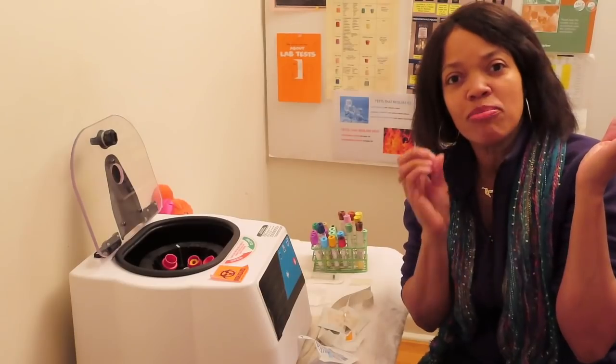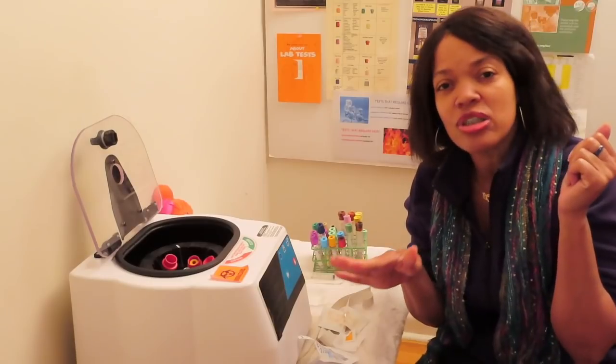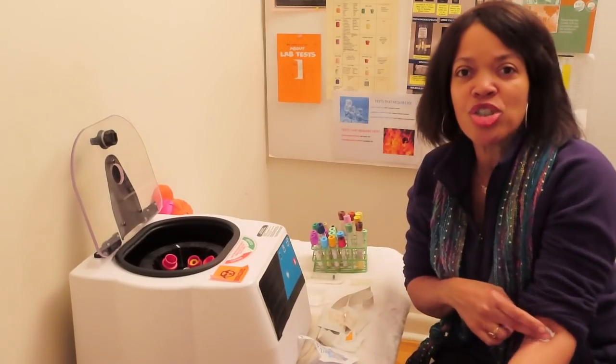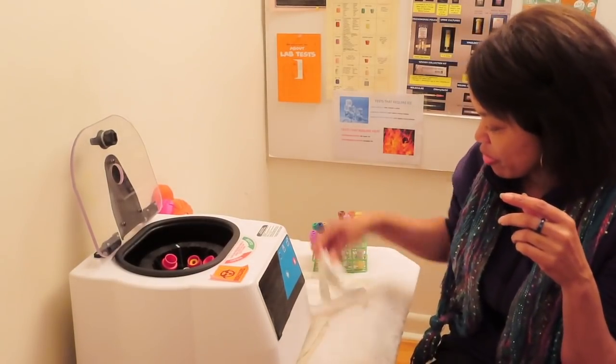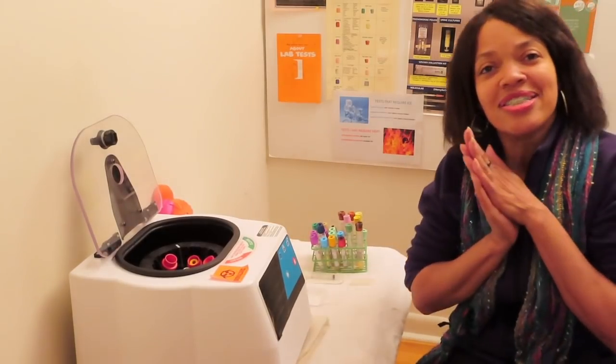Pressure is your friend. Pressure can alleviate bruising. Sometimes it's not the bad stick that causes bruising, it's not applying pressure. Make sure you apply the pressure or have your patient apply the pressure. Clean up your little area. Get rid of all of your trash, tourniquets, and things of that nature that you don't need. Now the time to spin.